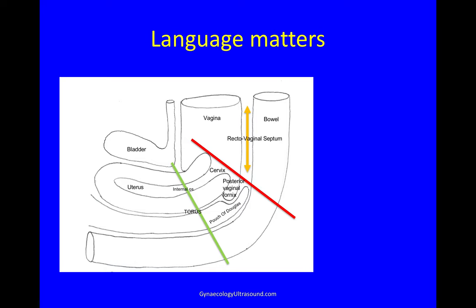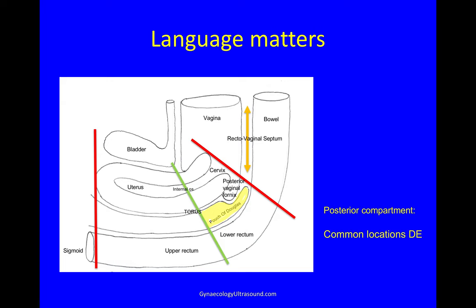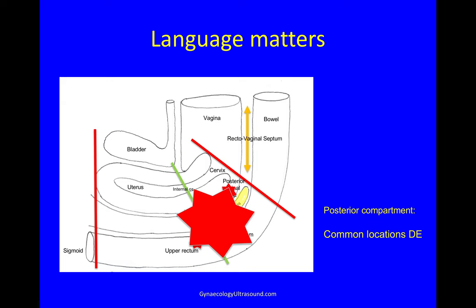This is the posterior vaginal fornix, this is the pouch of Douglas, and this is the bowel. Below the green line — below the level of the torus — is the lower rectum. The bowel above it is the upper rectum, and if you draw a line with the uterine fundus, then bowel above that level is called sigmoid. This is slightly arbitrary, but if we all use the same words we'll all know what we're trying to say. We call this area behind the uterus the posterior compartment, and common locations for deep endometriosis are the posterior vaginal fornix, at the torus, in the lower rectum, and in the upper rectum — and sometimes you have all of them together, adherent to each other — and that's called a frozen pelvis.